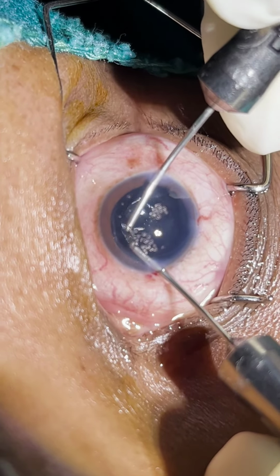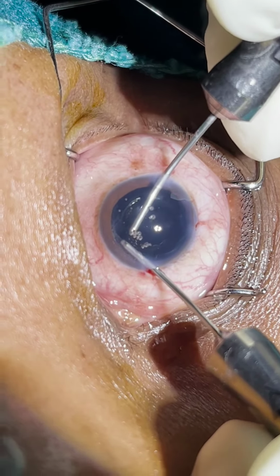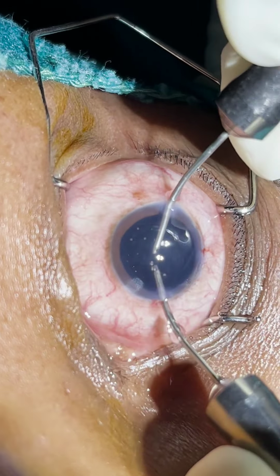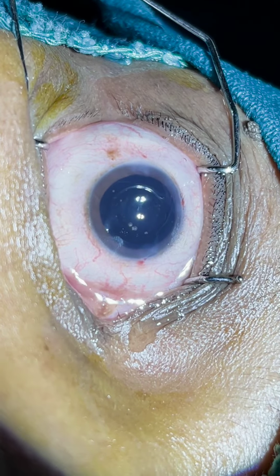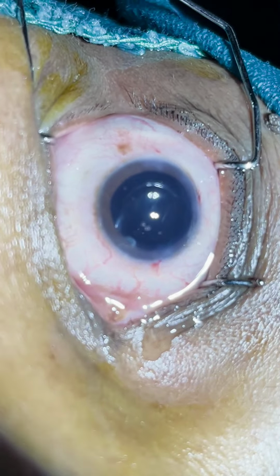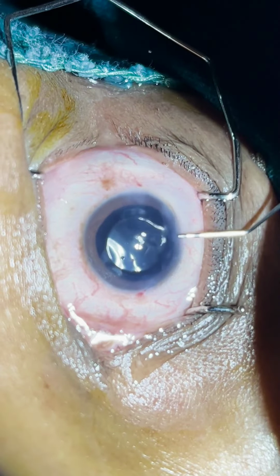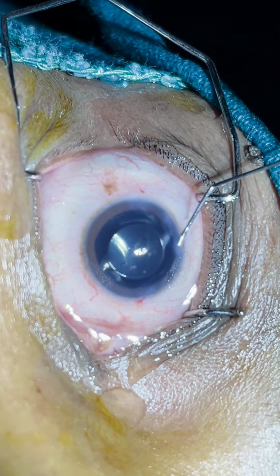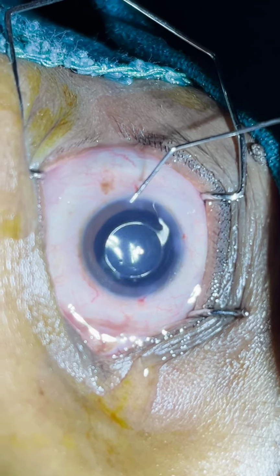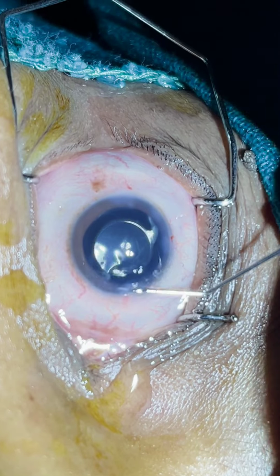I'm just washing out the remaining viscoelastic substance. Now I'll just hydrate the side port and the main port. In such cases when there is thick PSCC, make sure we do a thorough PC polishing, to avoid early post-op secondary cataract formation or PCO formation.